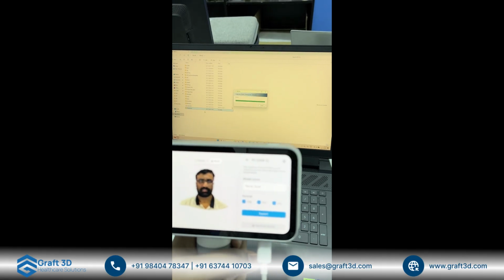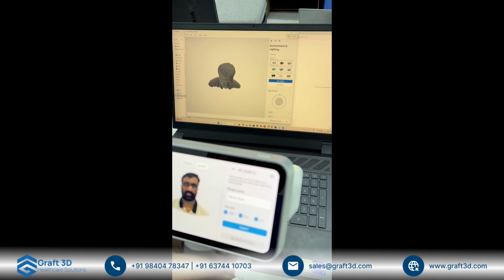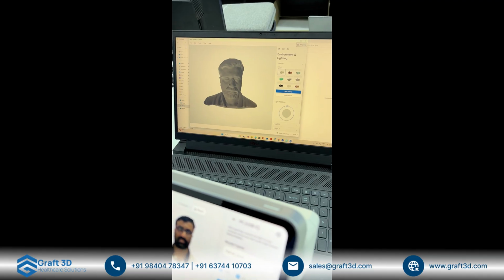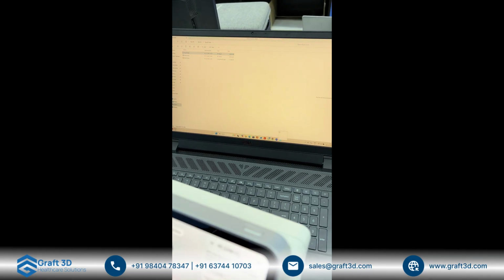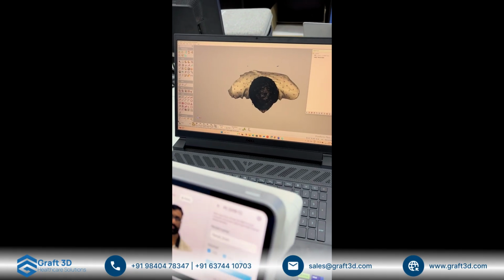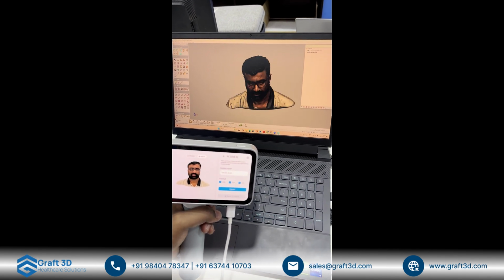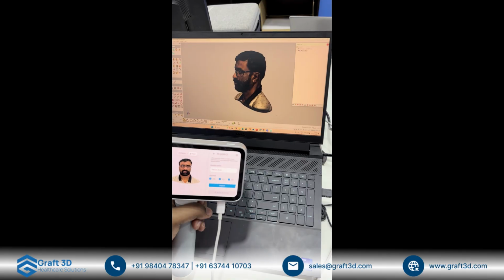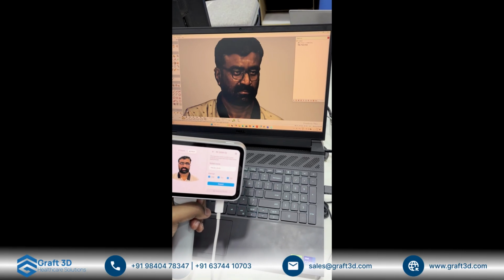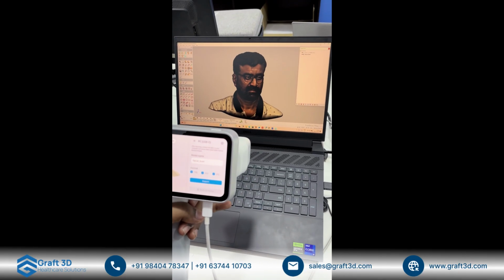Just focus here, focus on the scanner now. Don't notice, okay. Done. Pause. Let's stop it.